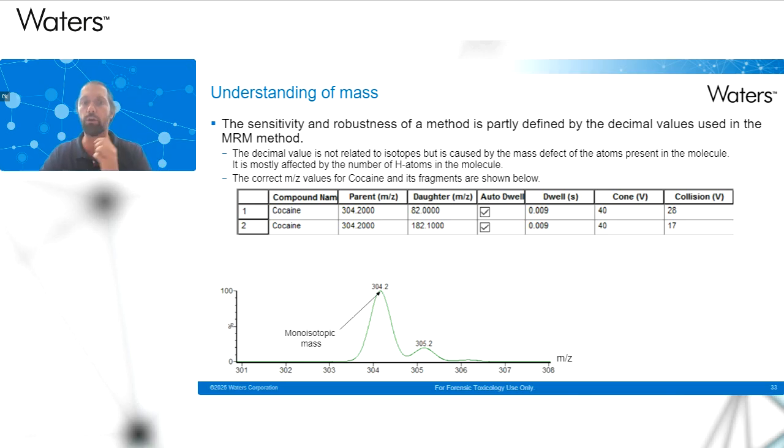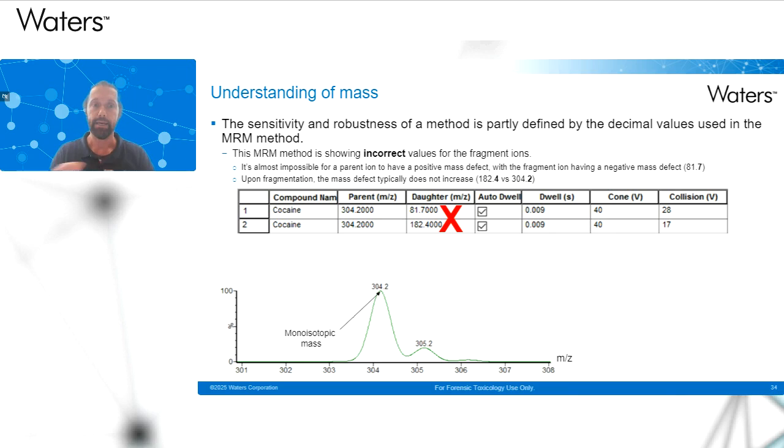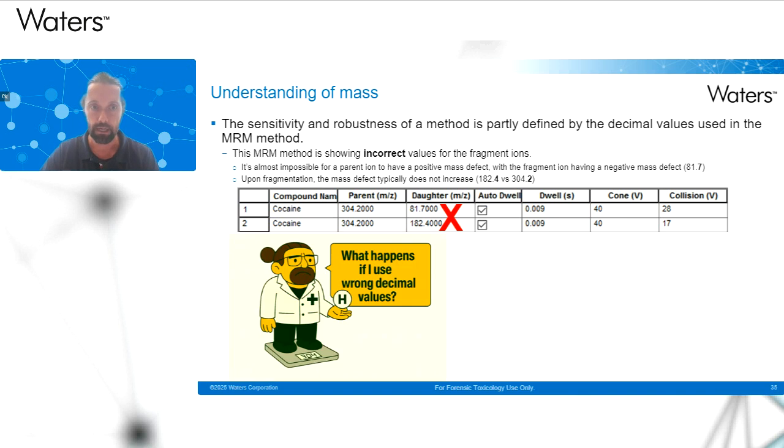So what you see over here are the correct m/z, mass to charge values of these cocaine mass transitions. These would be incorrect values. So this mass 304.2 is what we call a positive mass defect. Typically, a molecule cannot change to a negative mass defect upon fragmentation. So the 0.7 value is an incorrect value. When we are fragmenting cocaine, we can never add more hydrogens to our fragment ion, meaning the decimal value in your daughter cannot be higher compared to your parent. So these decimal values are very, very important.